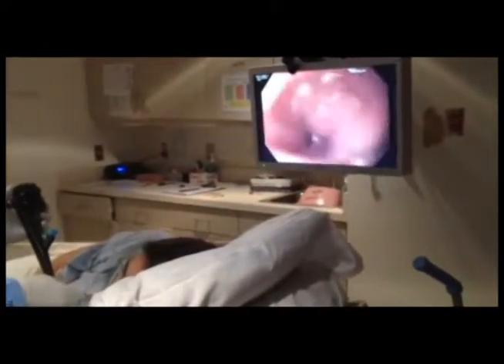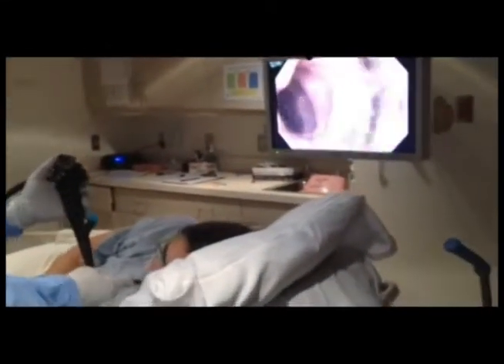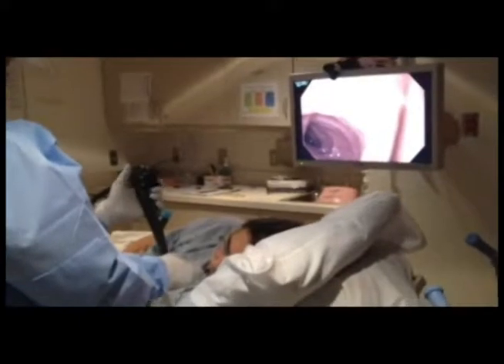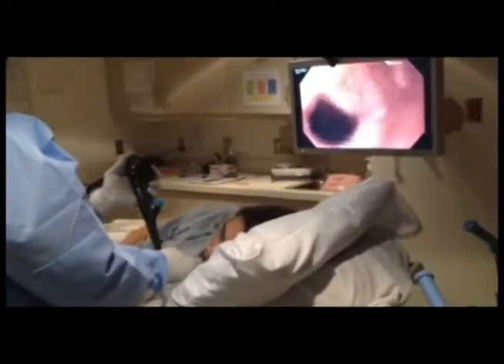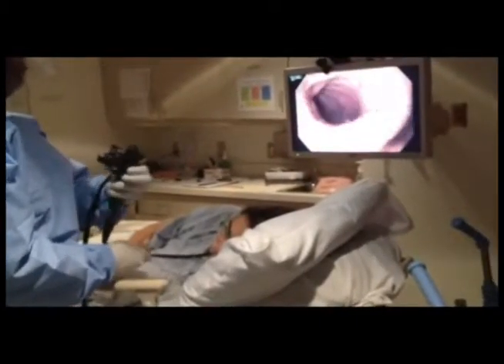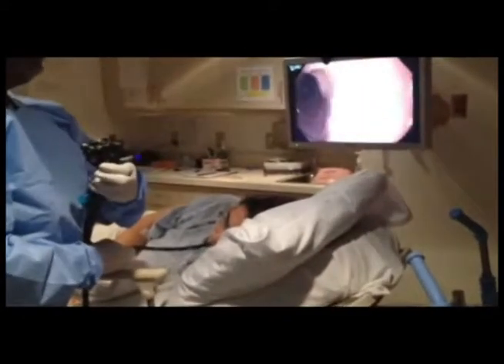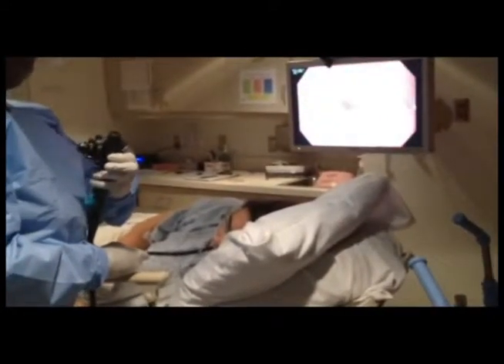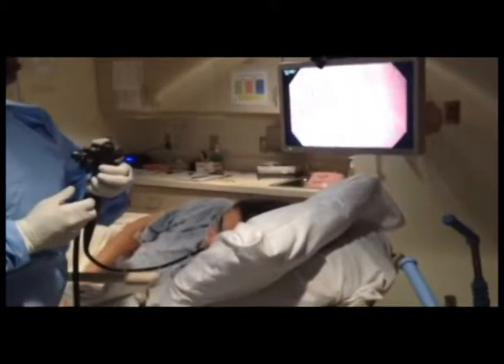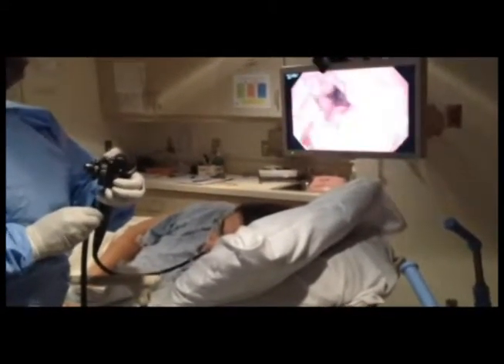The scope is already in the duodenum. You can see here on the monitor there's fluid already in the duodenum. We're going to aspirate that fluid with slow, gentle suction. We'll get a couple photographs while we're down here and slowly aspirate the fluid. The 45-minute collection usually does not have as much fluid as the earlier collection, and we just slowly aspirate, collecting the juices.